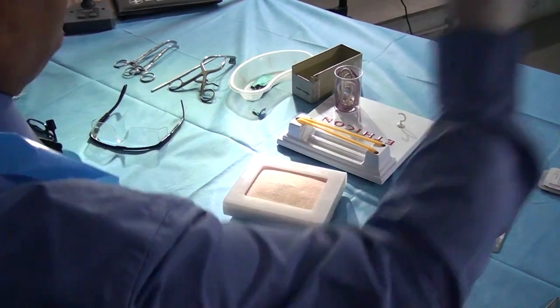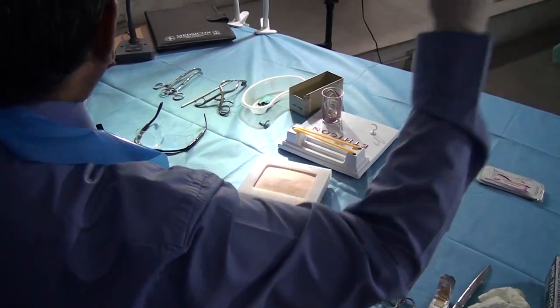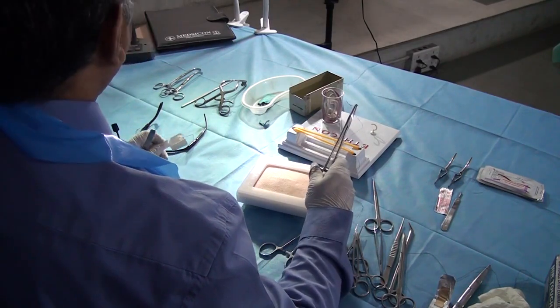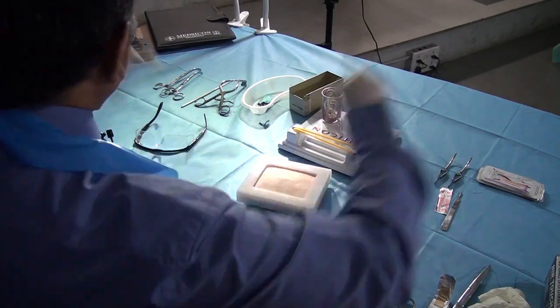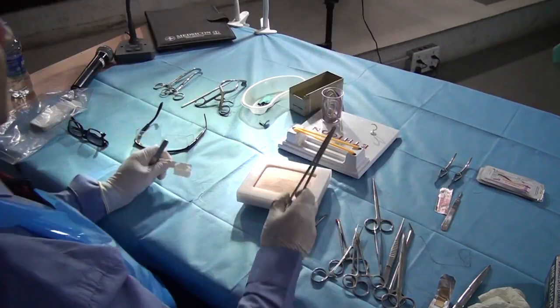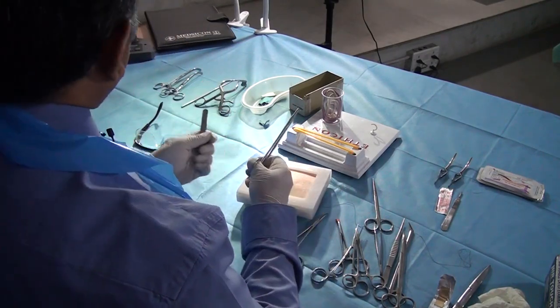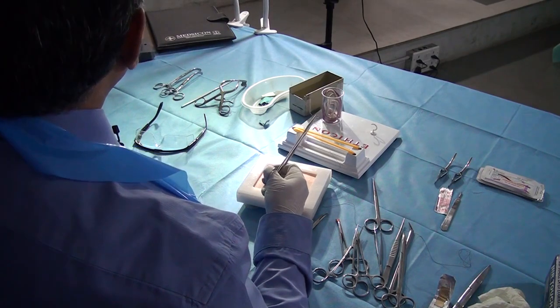And certainly not both. You do that most often. First one, needle away; second, wrapper away; third is both. You ever watch a nurse do it? People are ducking for help. So be careful. Don't do that. You take just the wrapper away. Clear? Clear to all? Yes, sir.